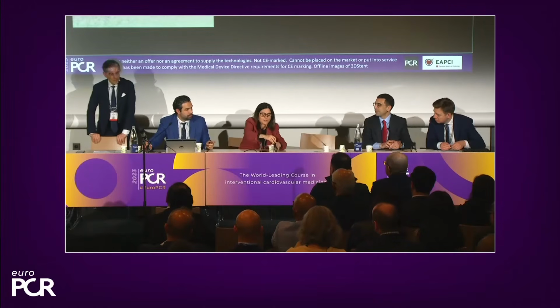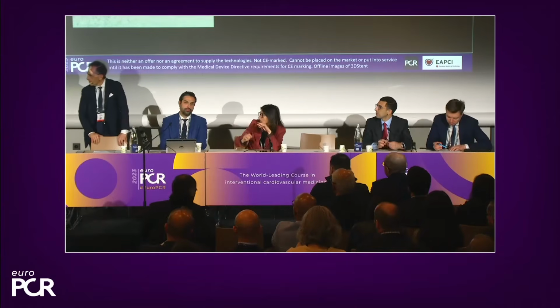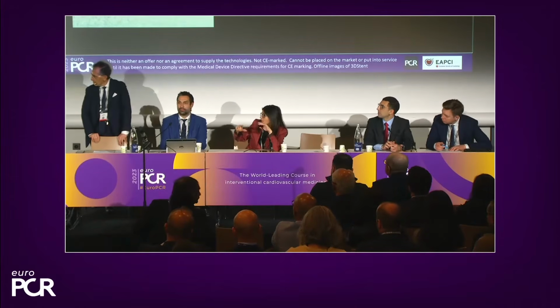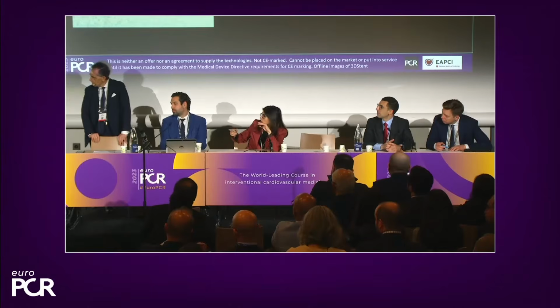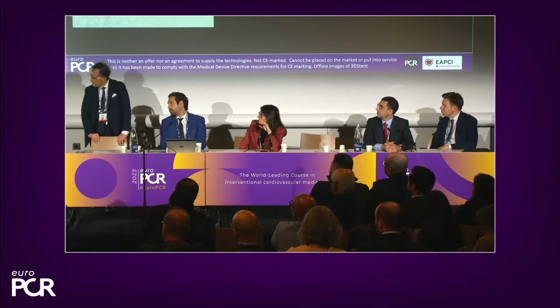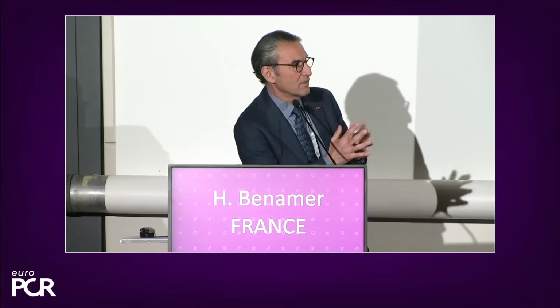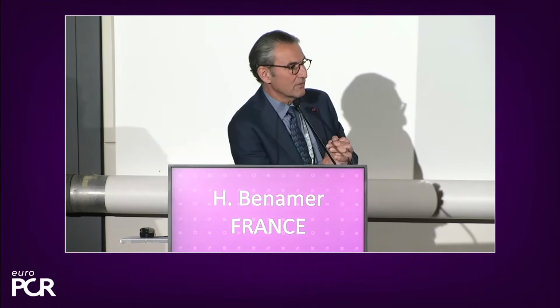I had a question actually about the balloon. So you said that you need a long balloon to do the acquisition. Can it be done with the same balloon of the stent, or do you need to? No, yeah, it's a very good question. You only need the balloon to cover the stent area and the area you want to study. So that's the only thing you have to do.